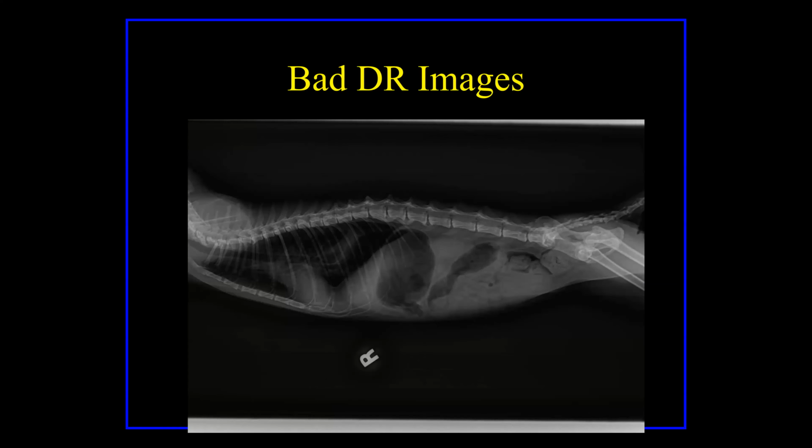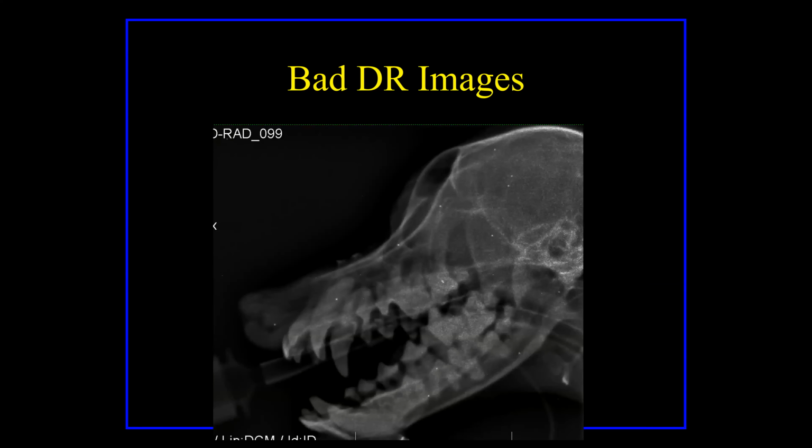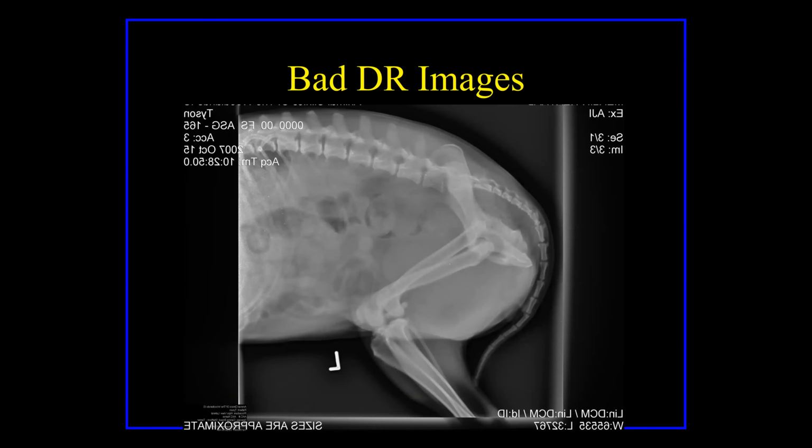Okay, so this is a bad image. I wouldn't be very happy if I spent 20 grand on this system and I got images that look like that. But people do, and they regret it, because they get talked into it by some vendor, the sales guy at a meeting. So again, horrible image quality with these CCD based systems. That's all you need to know.